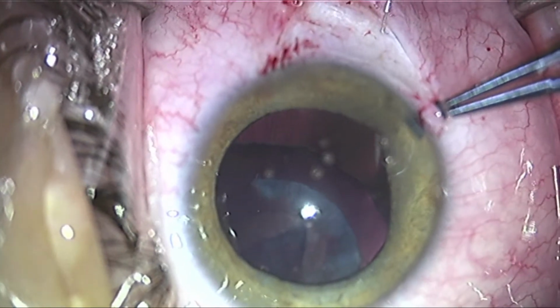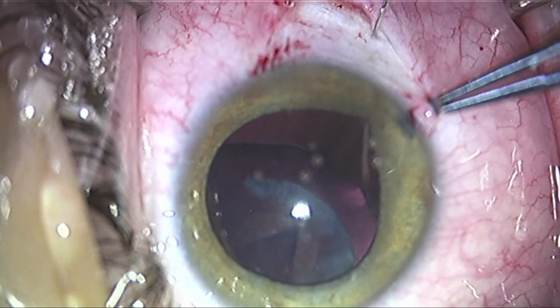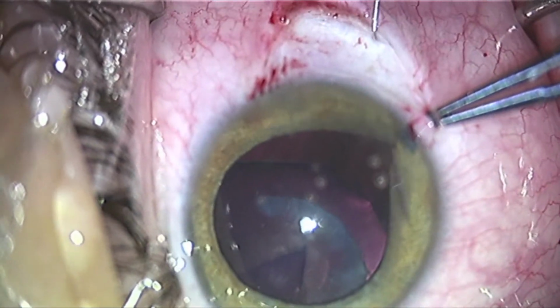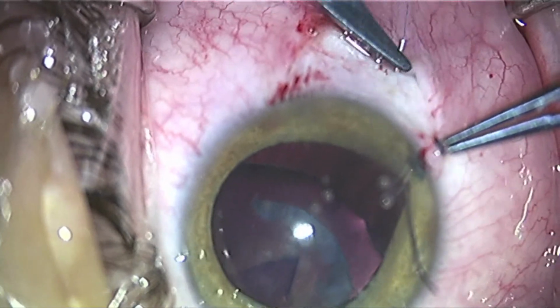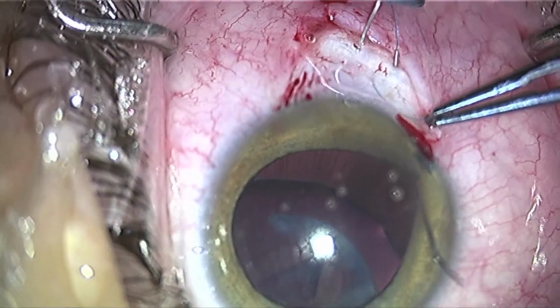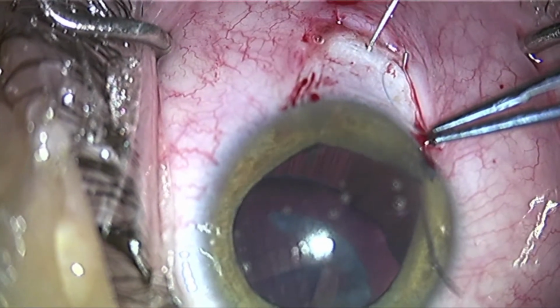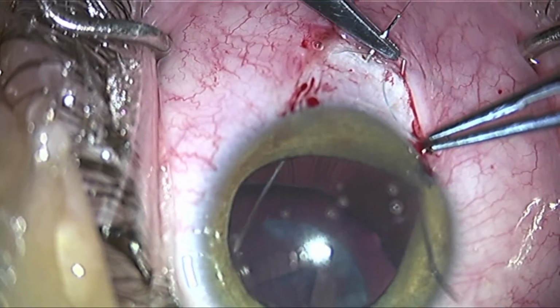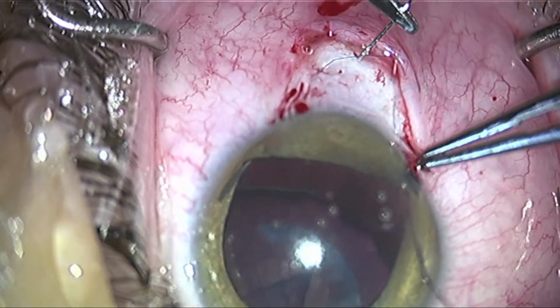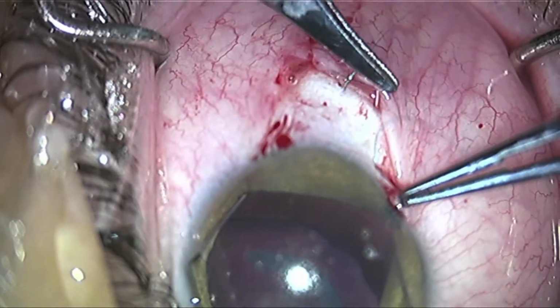And then this long CTC 6L needle was passed with a 9-0 Prolene attached through the sclera, underneath the iris, around the lens, and then up through the cornea. This is a double arm suture, and you can see here's the second arm going in a similar fashion, again through the sclera, avoiding the lens, underneath the iris, and then out through the cornea. It doesn't really matter where you come out through the cornea, you just want to bring it out somewhere away from the visual axis.